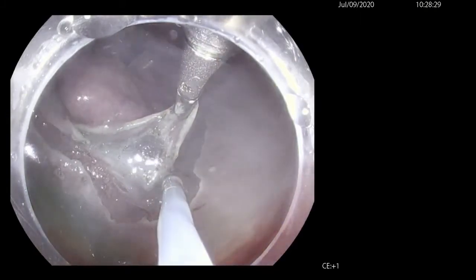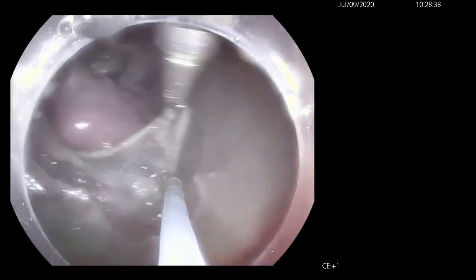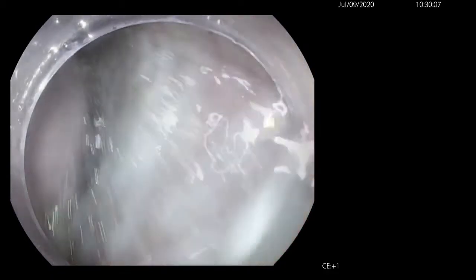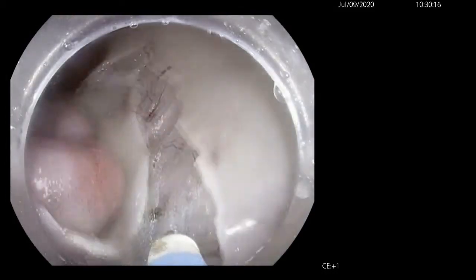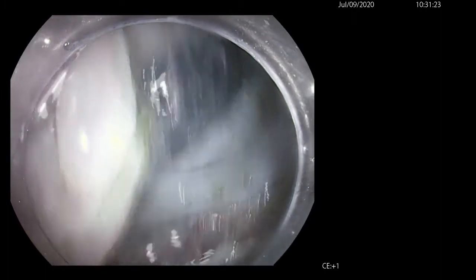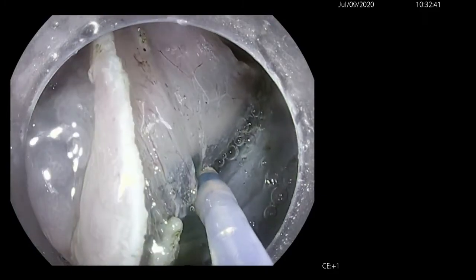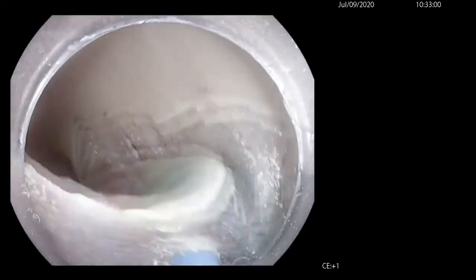As you can see here, the flexible grasper allowed us to utilize the dual knife far away from the lesion, which can increase knife maneuverability and also allowed us to utilize the traction of the flexible grasper effectively. In occasions when the endoscopist prefers a closer look at the submucosal plane, the device allows the scope to advance under the grasper to provide a closer look with micro-movement, particularly to dissect fibers closer to the edge of the lesion. Repeated submucosal injection is then performed to allow easier submucosal dissection under traction. The flexible grasper was constantly maneuvered to provide the adequate tension needed to maintain the traction. Repeated submucosal dissection is performed carefully and slowly to avoid any deep injury to the muscle layer under the lesion.